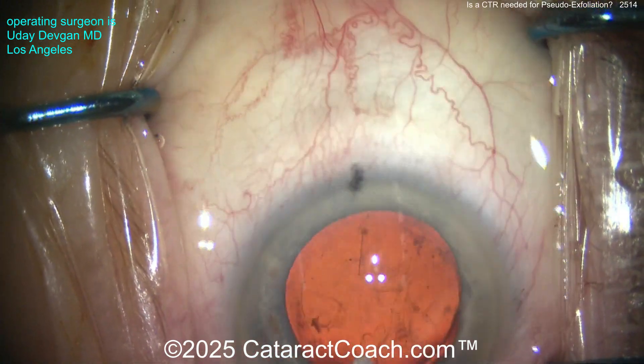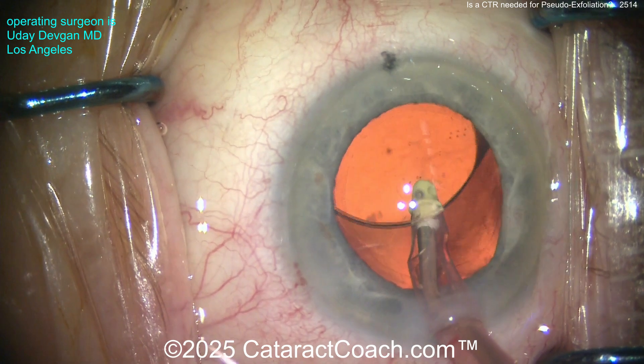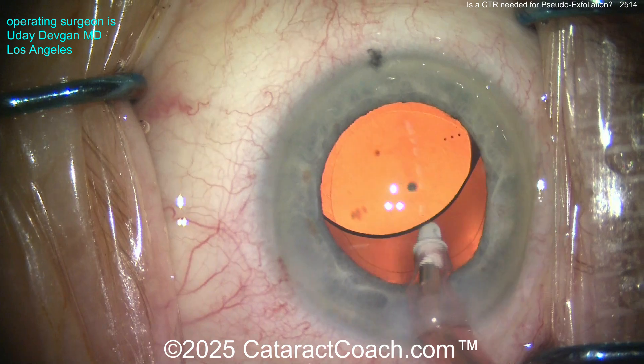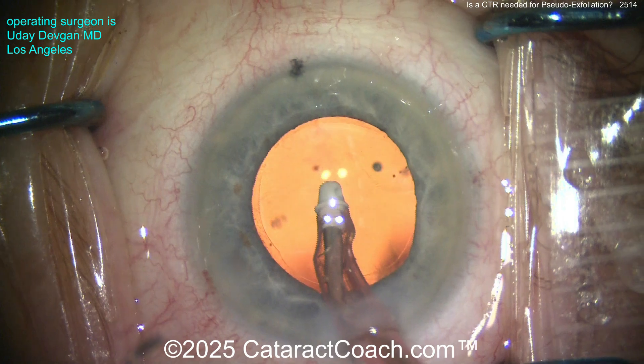The IOL is in the capsular bag. Going in with the IA probe to remove the viscoelastic — it's important to get the viscoelastic from behind the optic, because with a toric lens especially, you want the optic to sit directly on the posterior capsule. This material is slightly tacky so it will keep the lens in position.